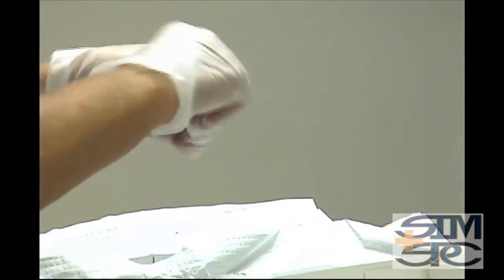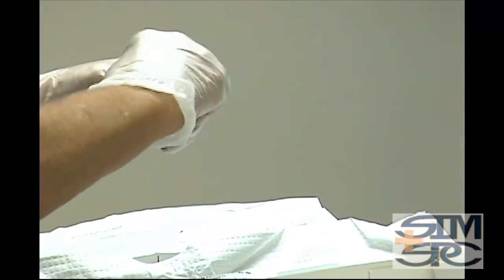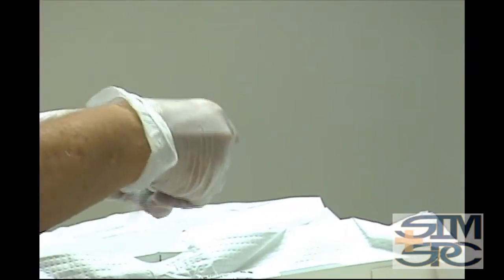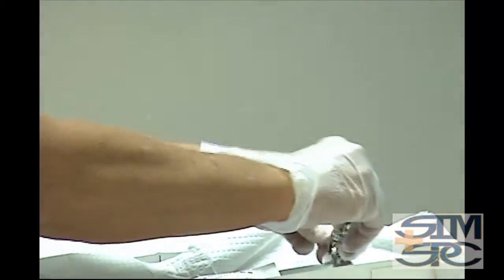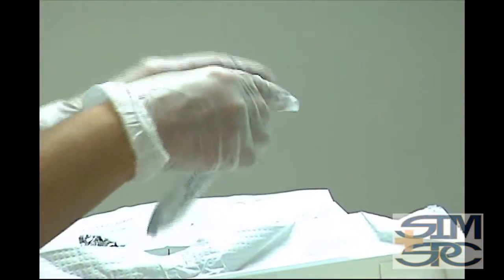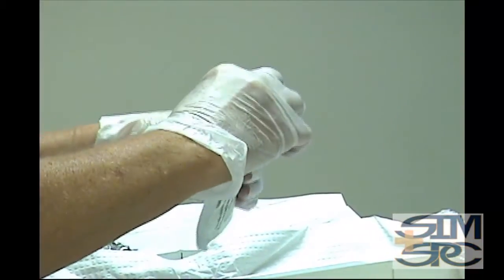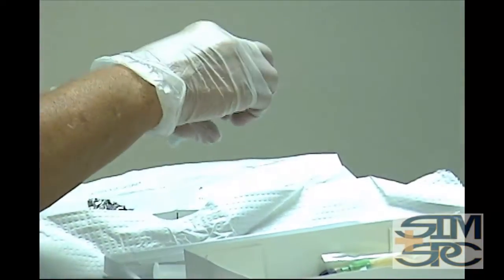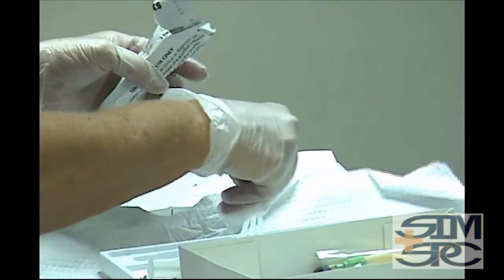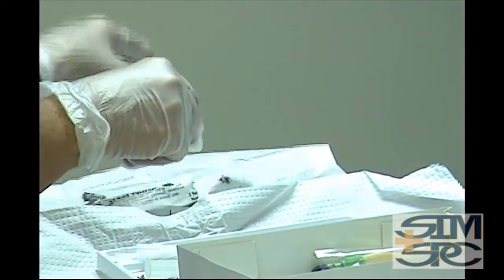And here is the KY. I'm going to go ahead and open this KY so that we can lubricate our catheter with it, and I'm going to put it in my tray right there. Once it's in there, I'm going to just drop it over here. I'm going to go ahead and open the other items and set them in here because this is all sterile field. That way I can just pick it up.